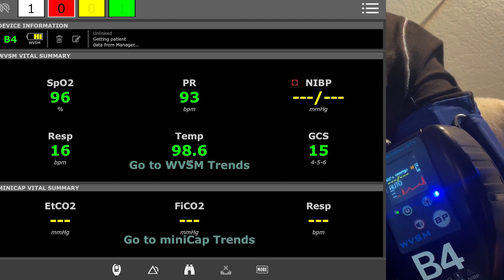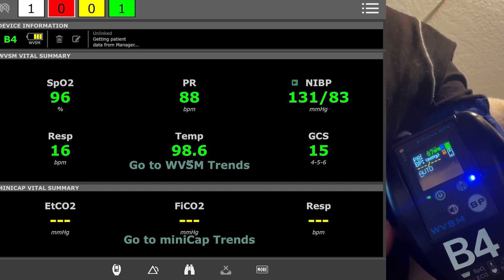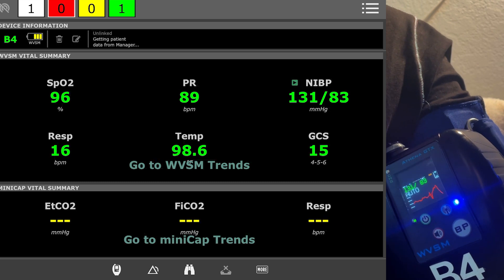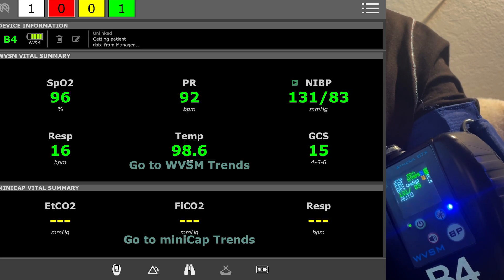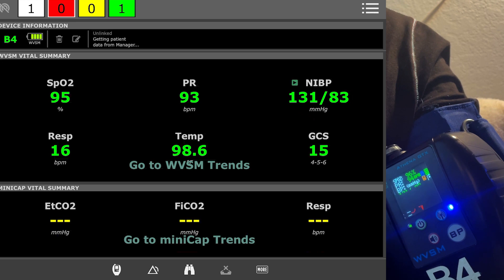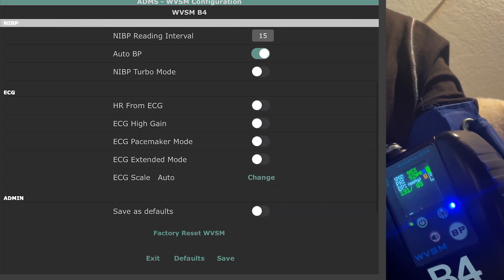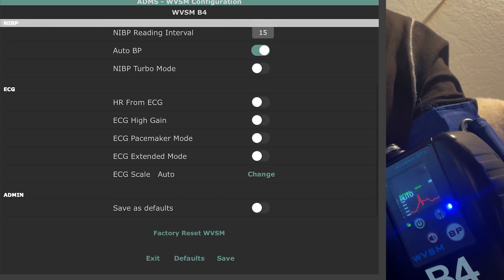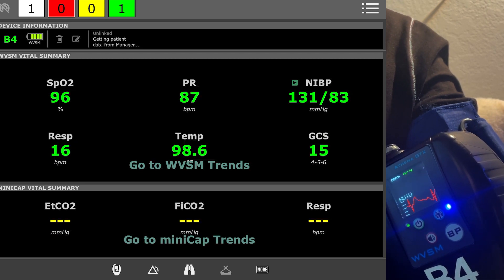It's going to alarm at me because it thinks something is off. As you can see, it pulled directly into the device here, which in this case is my iPad. I can go to alarms and adjust my alarm levels. I can go into my configuration — make it work by Bluetooth or by cable, allow it to auto shut down, do extended mode on the ECG.